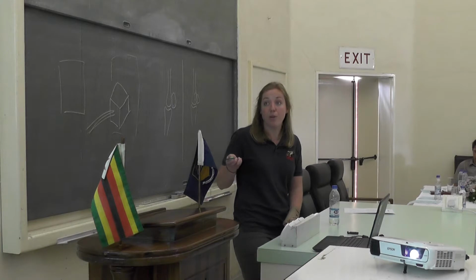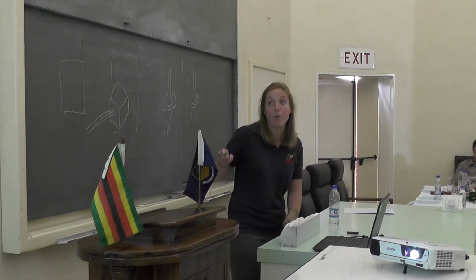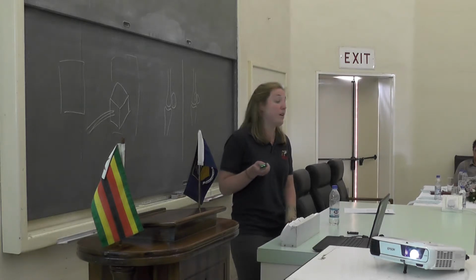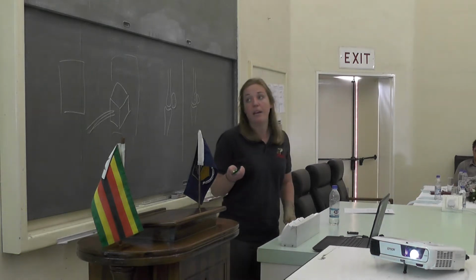You can center, so again, below the coronary band. This time the cassette is placed on the floor, but behind the animal, so on your palmar or plantar aspect, and the beam needs to be directed from the front of the animal, vertically to horizontally, to behind the animal. If you're doing hind limbs, you might be doing the opposite.